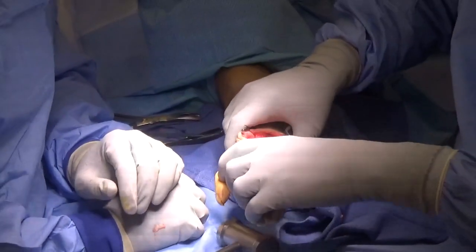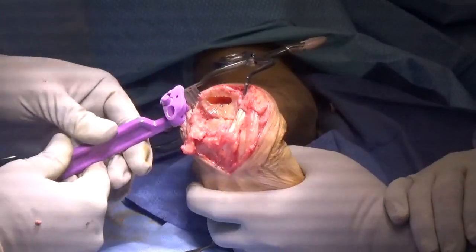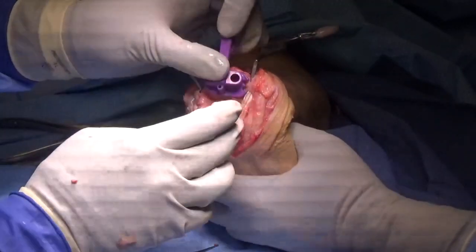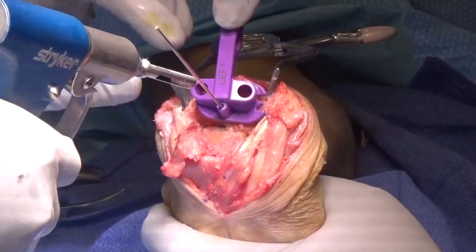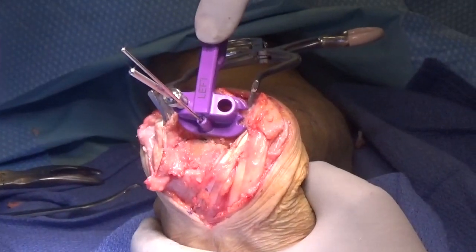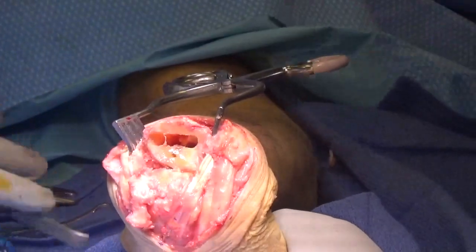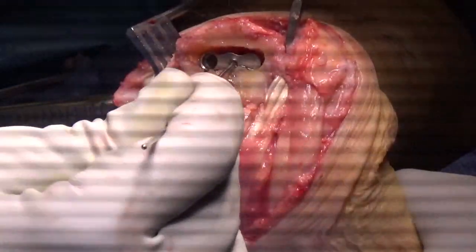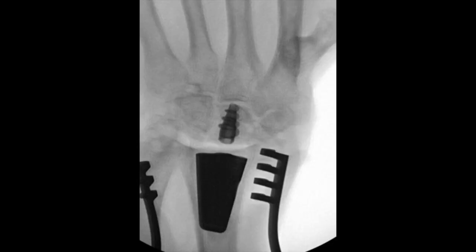As this was a revision case, I felt the wrist was still tight. So in this instance, we're going to ream further bone off the distal radius. To do that in this system, we're going to place the guide for the large component, restabilize with a pin, and then use the radial and ulnar core drills to re-drill the distal radius. What this did was allow us to insert the rail inserter of the depth guide further proximally, so further bone could be reamed. Fluoroscopic view shows ideal position.